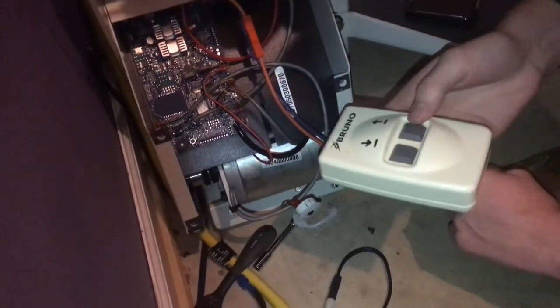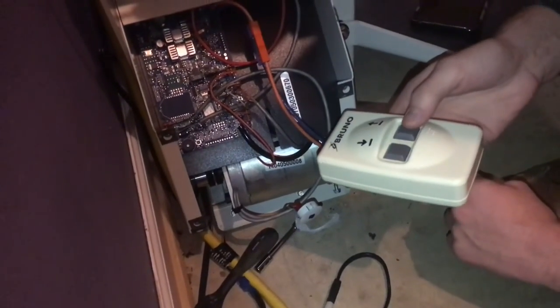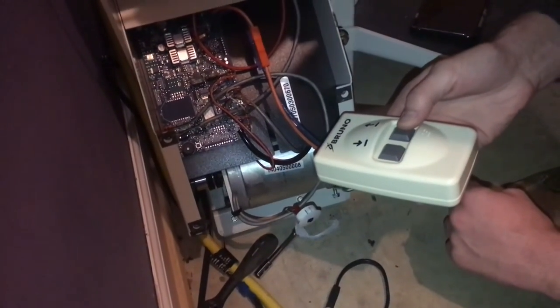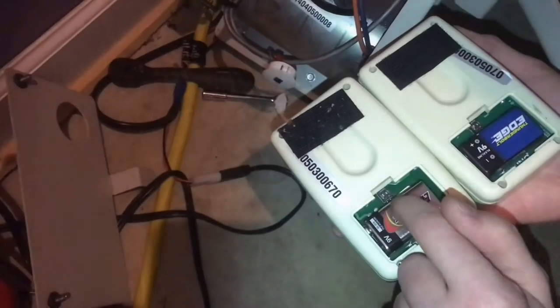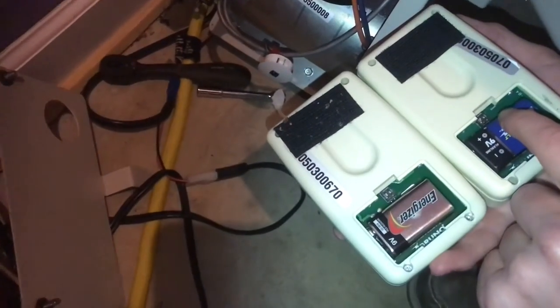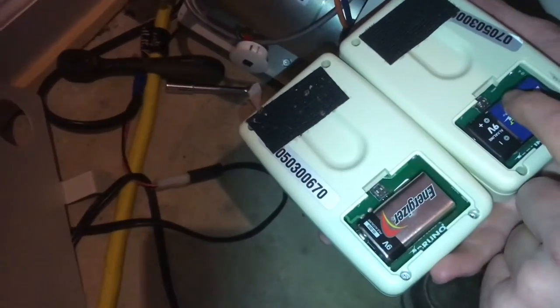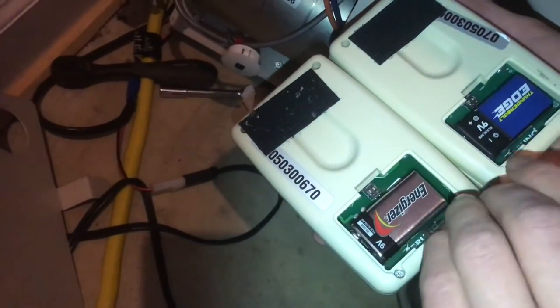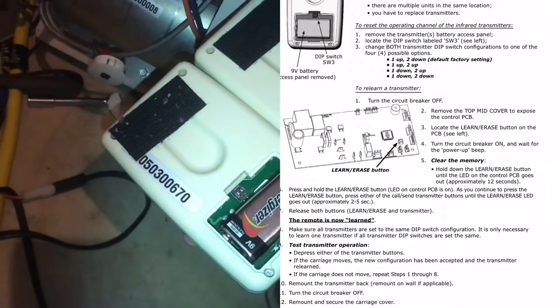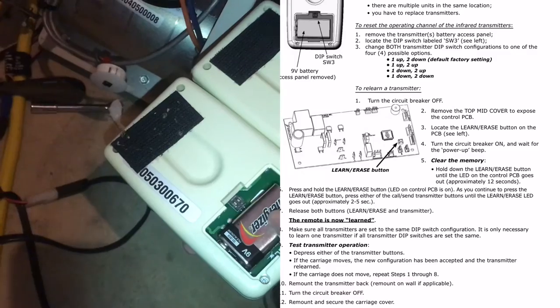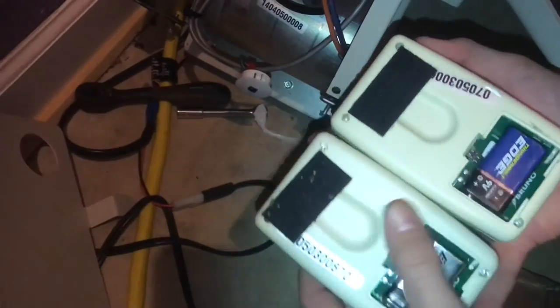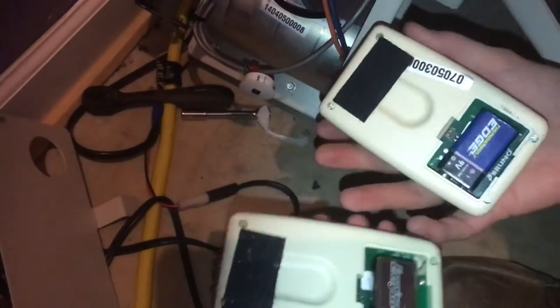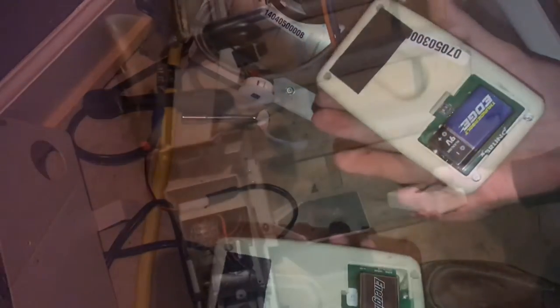And now when you hit the button on the remote, it moves. Those dip switches underneath the battery cover are both set the same. Basically they're transmitting on the same channel. They'll both work and you don't need to reset both. You would only need to reset one.